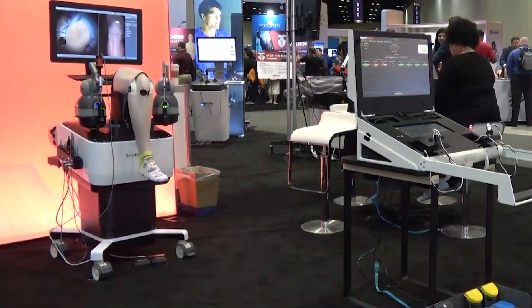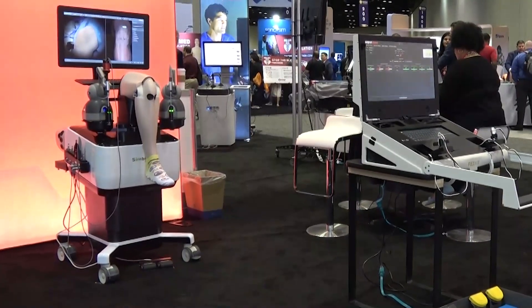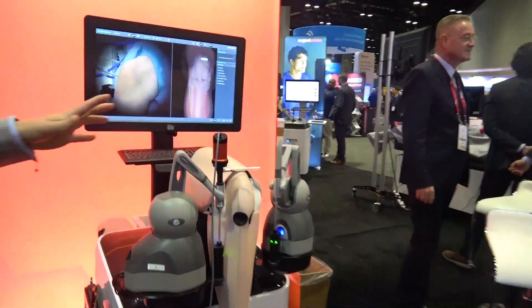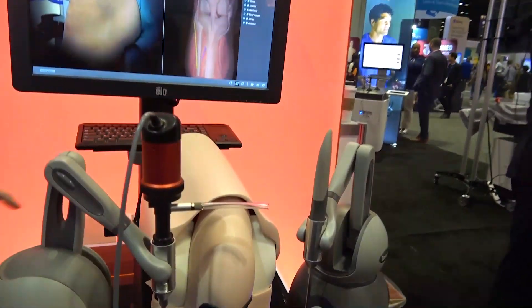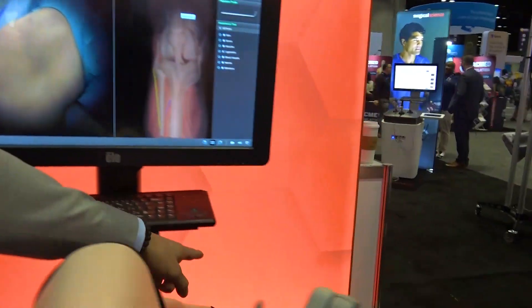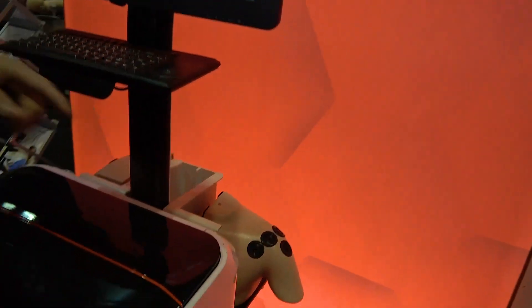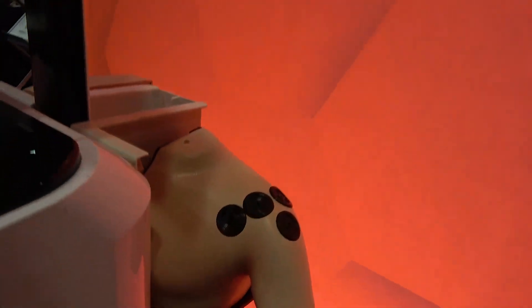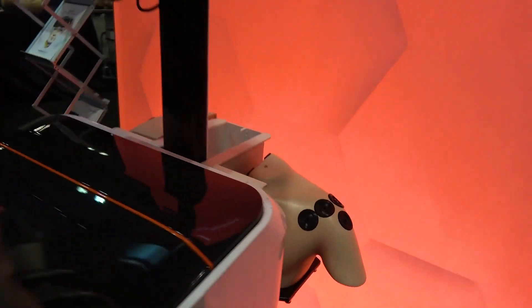The next simulator on the list is the ArthroMentor, which is for orthopedic procedures and arthroscopy. The simulator itself has a knee, a shoulder module on the other side, and a hip. This allows doctors to practice on a wide range of orthopedic procedures.